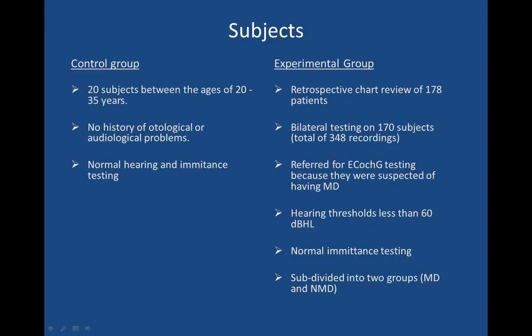That's an interesting point. One of the things I hate most is when I get a referral from a physician for someone who's had Meniere's for years and their thresholds are well higher or less sensitive than 50 or 60 dB. ECoG is not of much value when the thresholds are that bad because obviously in hearing losses, especially sensorineural ones of that nature, the hair cells are compromised. What I find ECoG to be most useful is in the early stages of the disease when we really don't know what's going on and the patient still has good usable hearing.